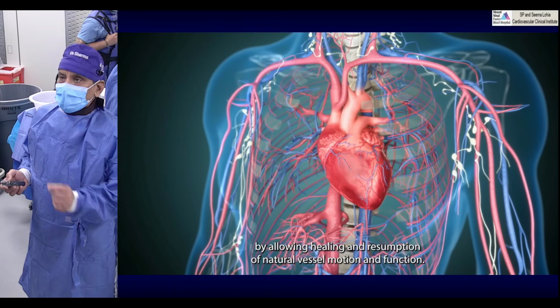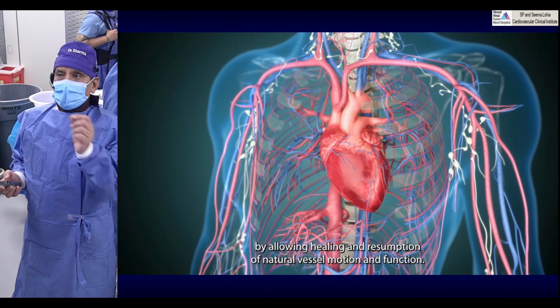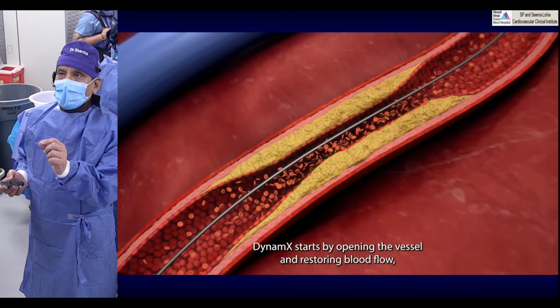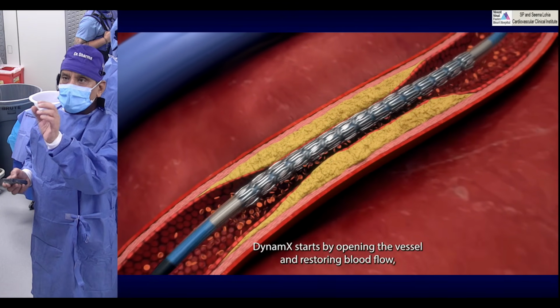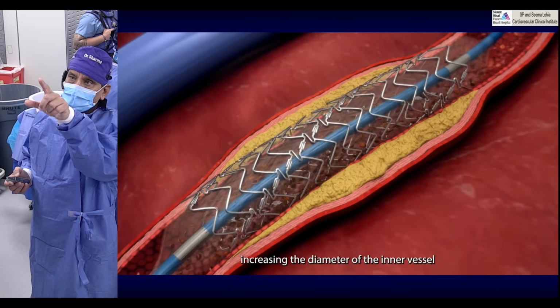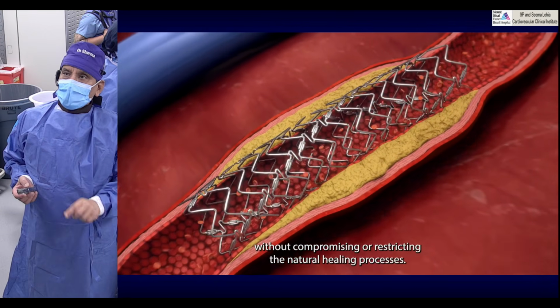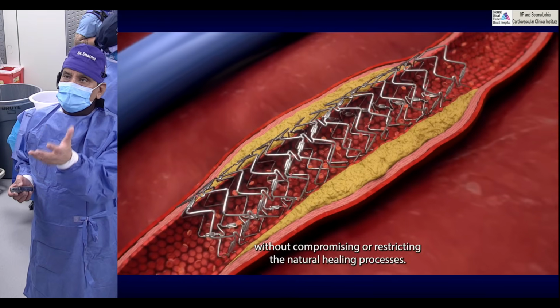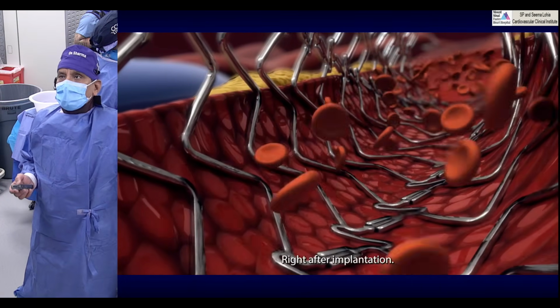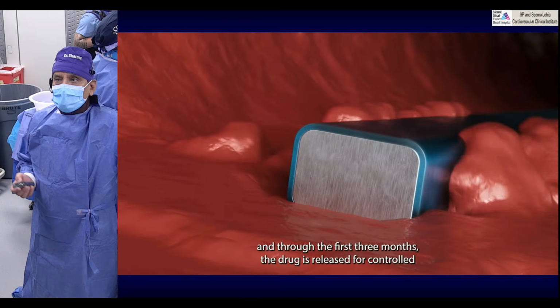So basically our stents usually are pure metal. And this is a proprietary design where the Dynamx has special interconnecting, you see the interlocks there, and they're covered with sirolimus and a polymer. And the polymer gets dissolved in 3 to 6 months, right?